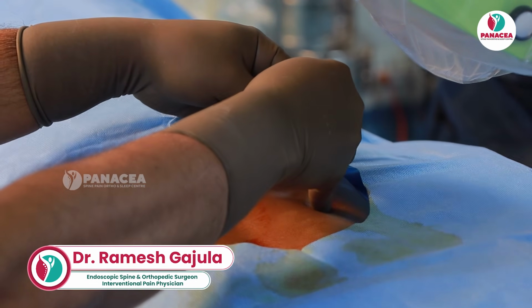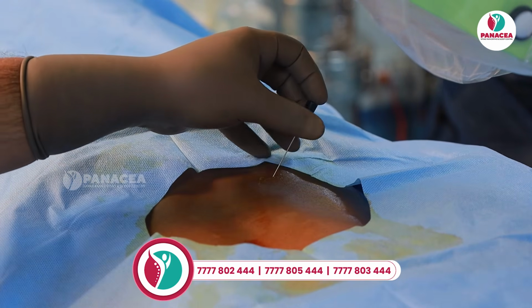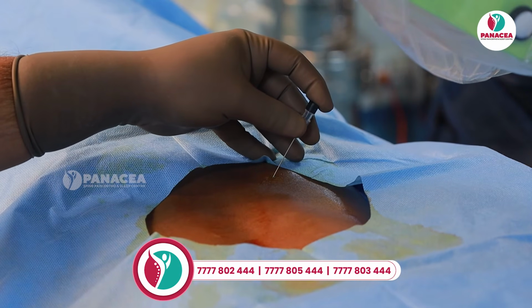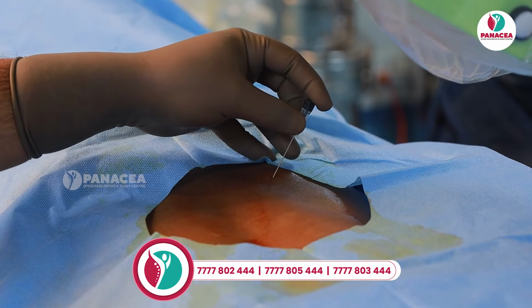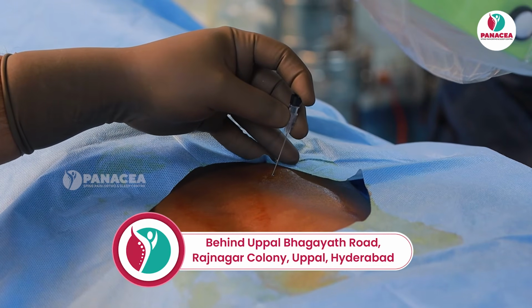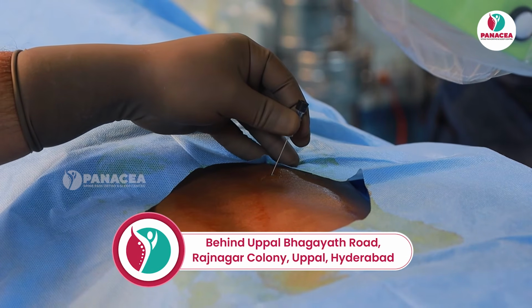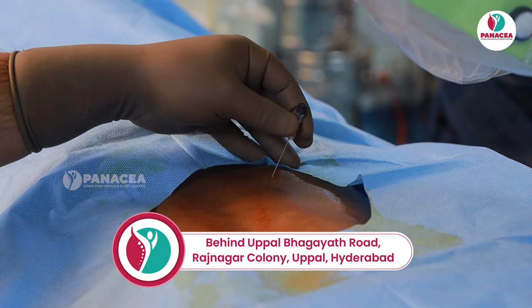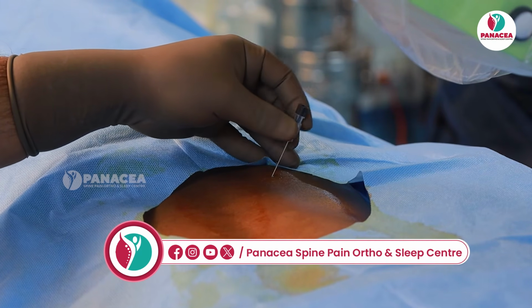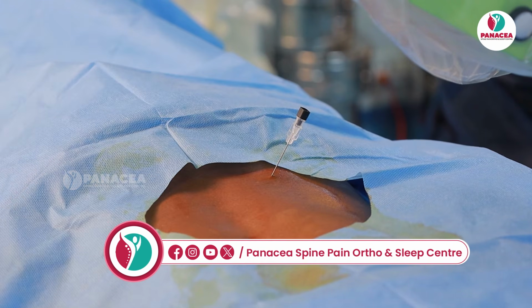You see, I am pushing it a little. Now after pushing a little, again I will check. My hub is going lateral again and hitting. See, I am hitting, still I have to slip. So again I am making the slot towards medial. I am pushing inside. See, I push a little more. Again I am checking whether I am hugging the SAP or not. So I am going to do this maneuver 3-4 times till I slip. See, now I slipped.